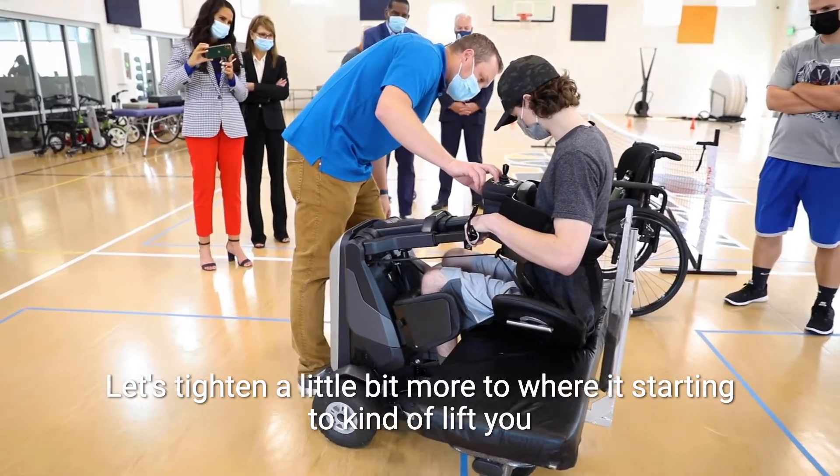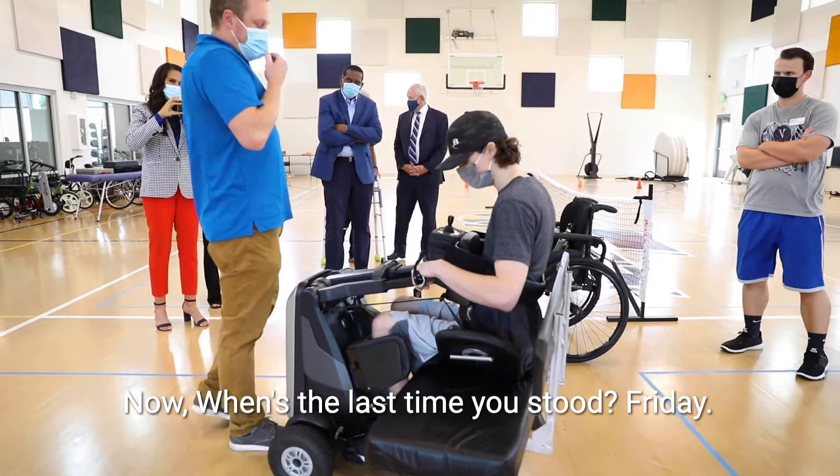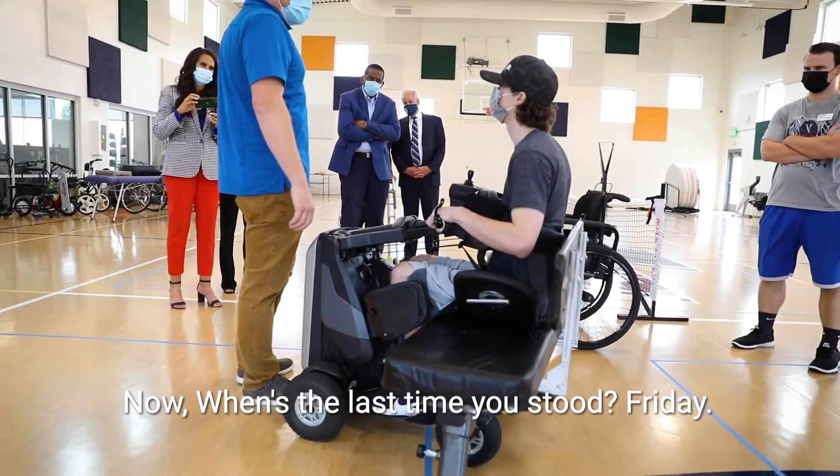I'm going to tighten these a little bit more to where it's starting to kind of lift you up off the bench. When's the last time you stood? Friday.